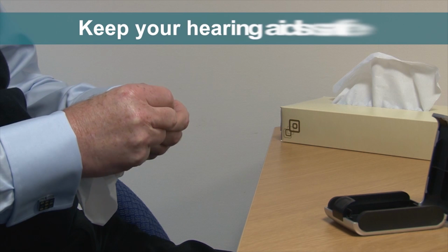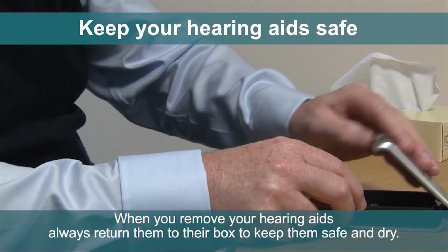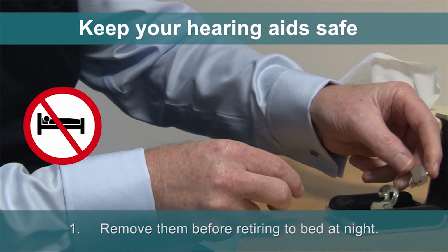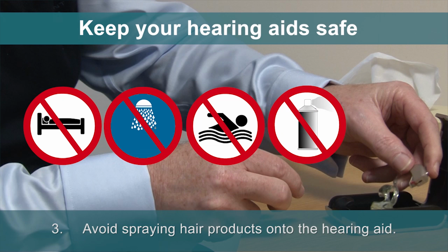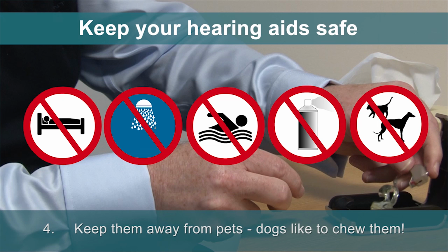Keep your hearing aids safe. When you remove your hearing aids, always return them to their box to keep them safe and dry. 1. Remove them before retiring to bed at night. 2. Keep them dry. Remove before washing your hair, bathing or showering, or going for a swim. 3. Avoid spraying hair products onto the hearing aid. 4. Keep them away from pets. Dogs like to chew them.